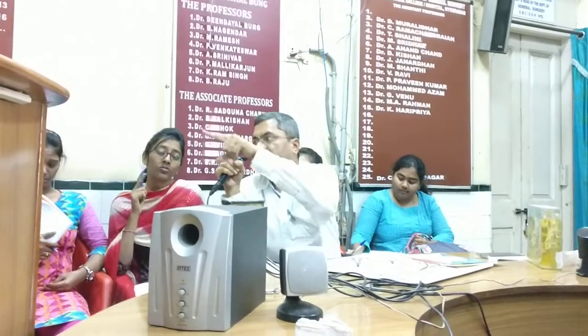So you remember: stag-horn calculus, multiple fluid levels, air under the diaphragm, then diaphragmatic hernia, volvulus, achalasia, peritonitis. Achalasia, that narrow lower esophagus. That you remember, okay? So any doubts in instruments, X-rays and operative procedures?